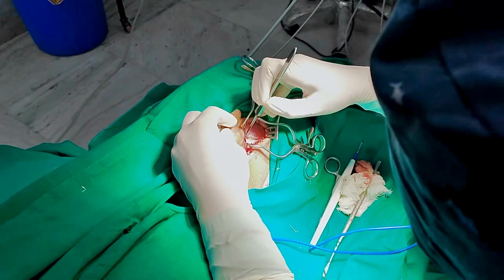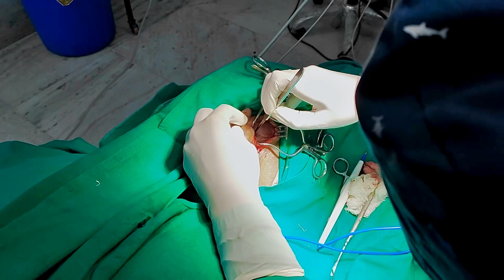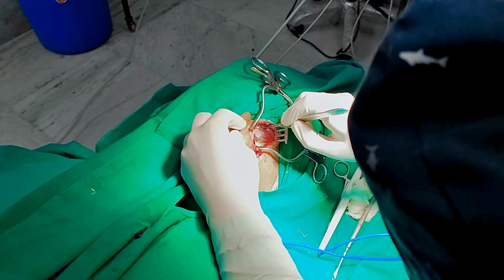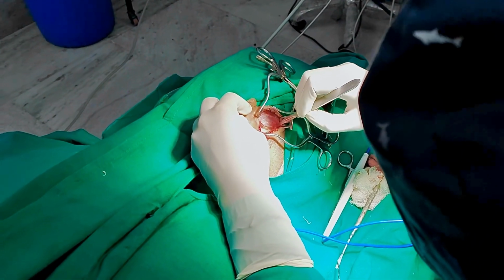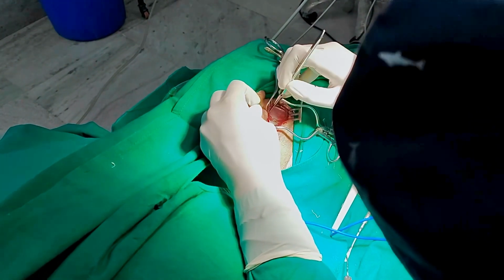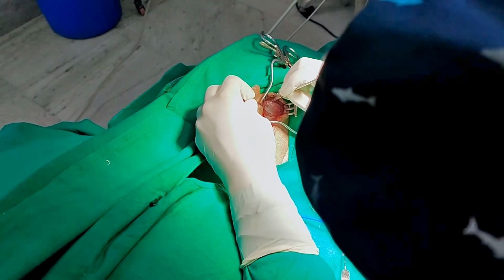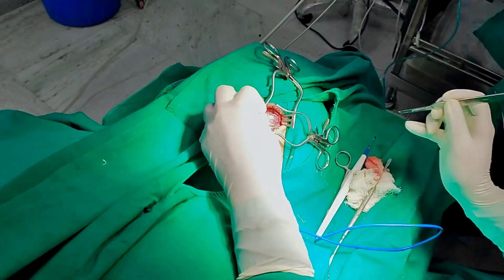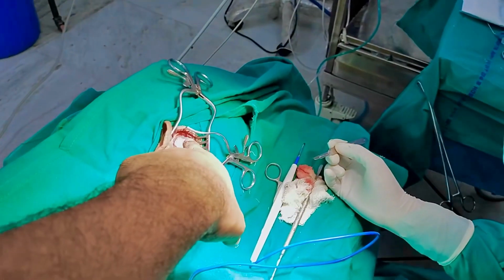In the meantime, let's talk about the position and the anesthesia in which the type 1 tympanoplasty is performed. Even other types of tympanoplasties are performed like this only. See, the patient is in supine position with the head turned to the other side. She is being operated on her left ear, so her head will be turned towards the right side. So that is the position of the tympanoplasty operation.